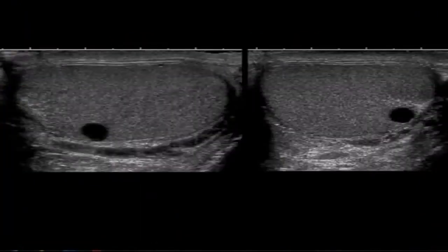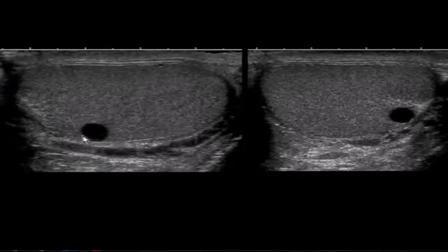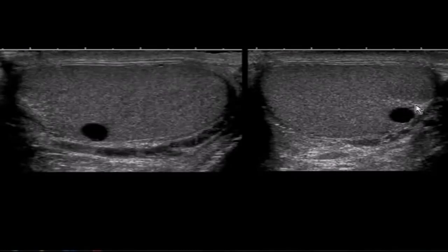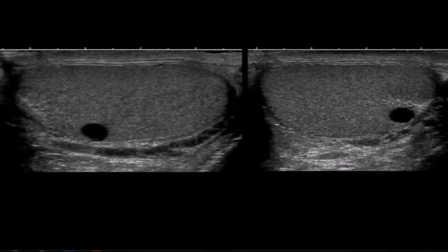Here's a patient with an intratesticular cyst — an anechoic lesion with thin walls on longitudinal view, and here it is on transverse view. Notice it's right next to the mediastinum testis, the area of slightly increased echogenicity at the edge of the testicle where the vessels and tubules enter and leave. This is the most common location for intratesticular cysts.